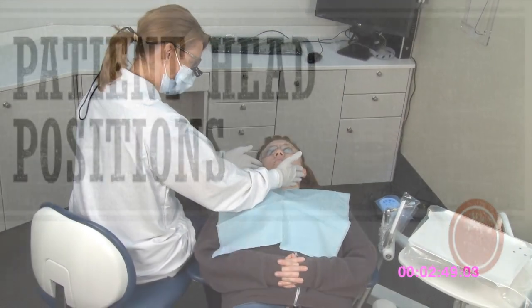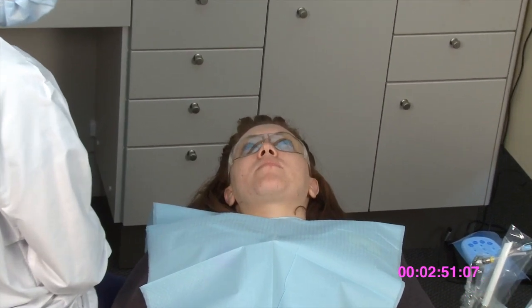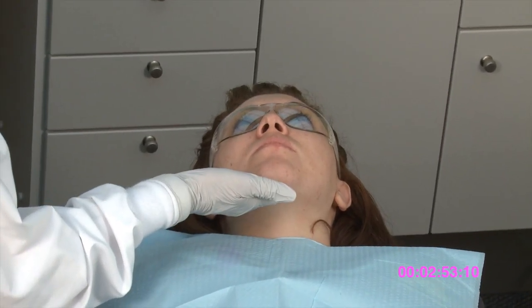Begin learning about our seating positions, there are a few things we need to learn. During patient care, it is important for you to instruct the patient in which way they should move their head in order for you to have the best possible visualization. Let's begin by having the patient in a neutral position. It is best to ask the patient to make their head straight.